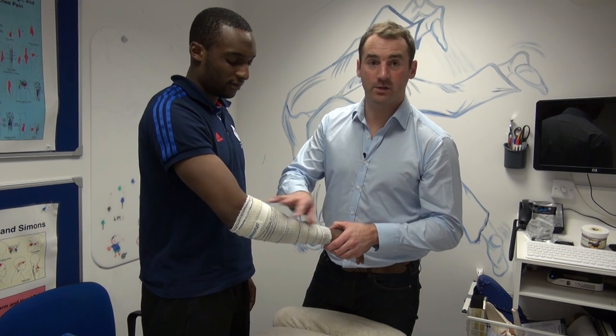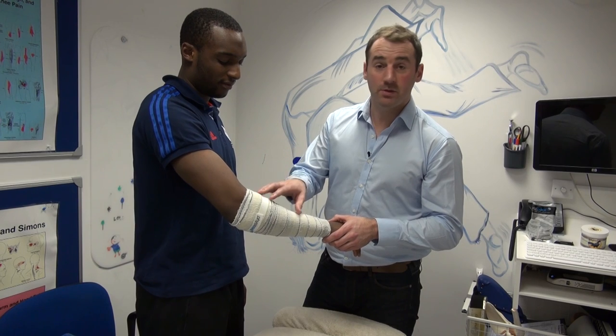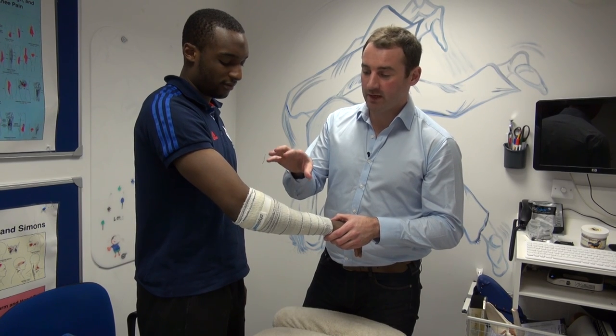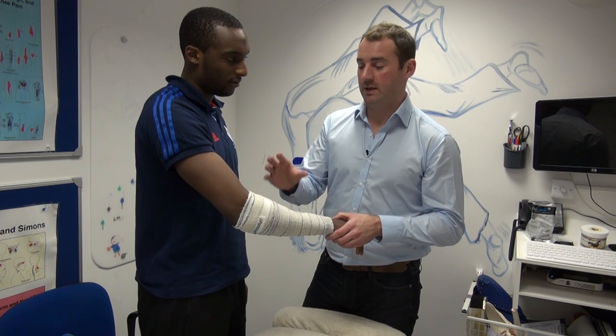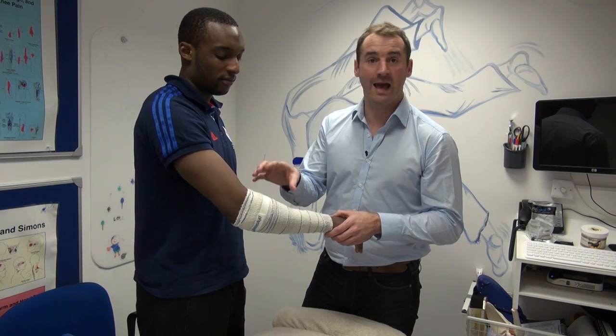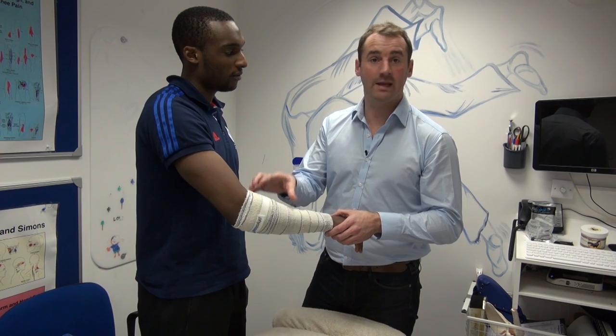Physical works instantly, straight from the packet. It takes two to three minutes before it starts feeling really cold. Then the limb will get colder and colder as the bandage is pulling the heat out of the deep tissue and evaporating the heat and inflammation.